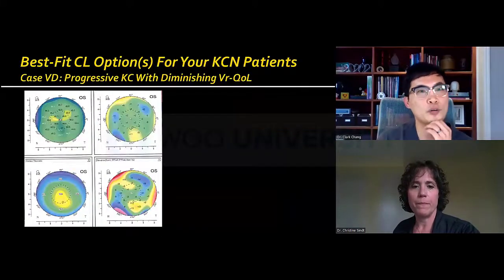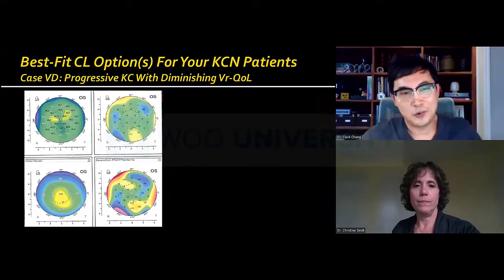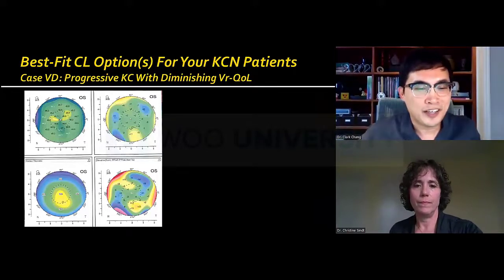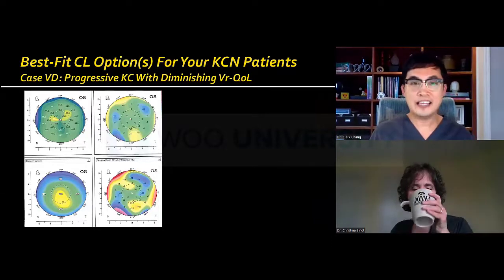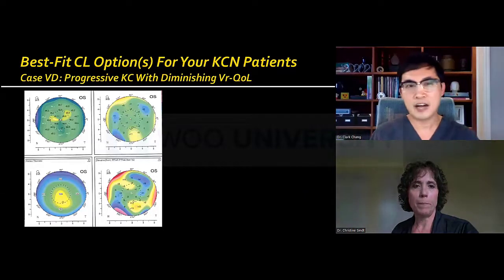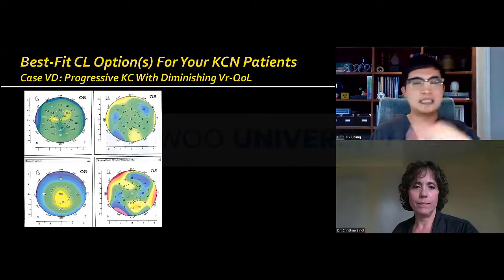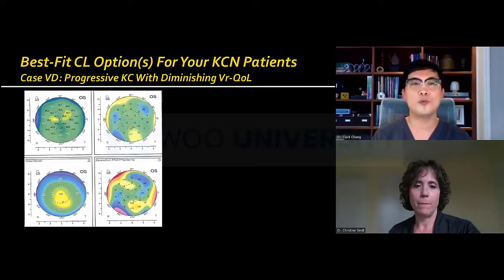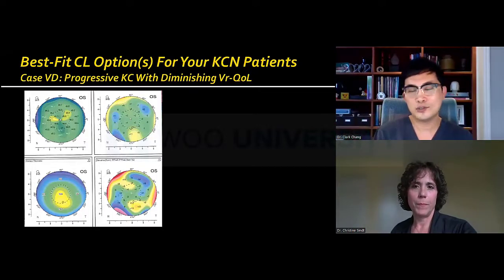Yes. And so going into our next case, this is actually a case that had always stayed with me because it's one of those cases where I thought, I wish we would have acted a little bit sooner. So this patient, left and right eye pretty similar, came with, "My prescription every 6-9 months, they just keep changing my contact lens prescription and always tell me that I see 20/20 and there was nothing that they could do anymore.